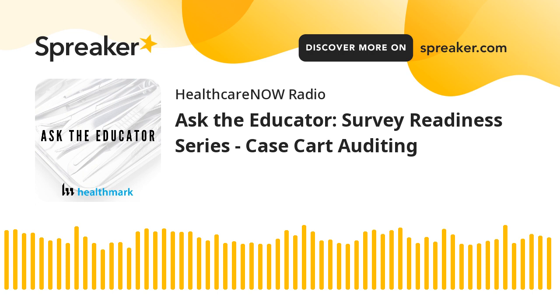Yeah, it's very interesting, Kevin, and thank you for the insight. When we're live, one of the things I like to do is ask a certified surgical tech, or someone who scrubs, or an OR nurse, you mind if I ask you some questions? Usually it's, how were you trained? Did they tell you to wipe instruments off and so on? And he said yes. I say, well, why isn't it happening all the time if everybody's been trained this way? When they're doing an open heart, you wipe down the Castroviejo scissors and it's ready to give back. Okay, so they're closing now and you don't have to wipe it, but you always have to make sure that in case they have to open, the instruments are ready to go. Why do people forget about it?